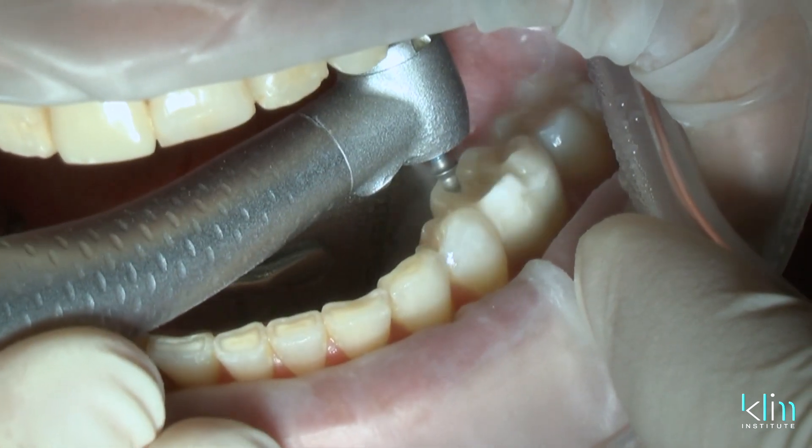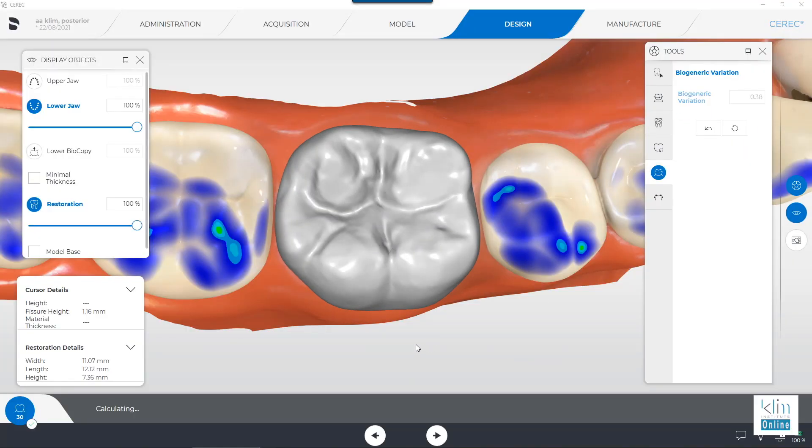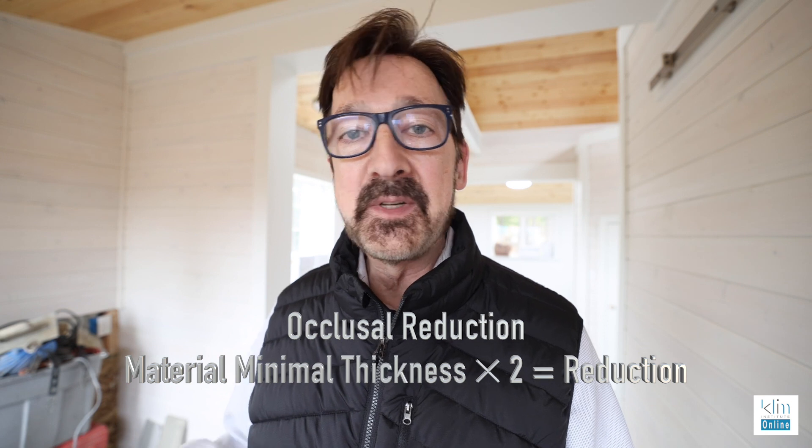Another concept we have to be aware of is occlusal reduction, so we can get ideal morphology for the case, because if we don't have enough reduction, then we have a compromised occlusion, and that's when we start to get interference. By getting enough occlusal reduction, my criteria for that is minimal thickness — we're gonna reverse engineer — so minimal thickness of the material you're using times two. Usually that's going to be around one for most of our products today, like Emax, unless we're in zirconia, like the 4Y that's 0.8 and the 3Y is 0.6. Then we can reverse engineer our prep, knowing that our morphology is going to fit the case with the AI software.